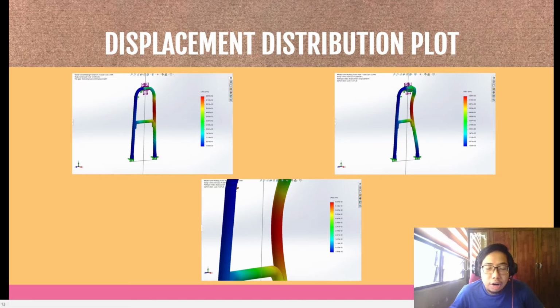When the force is exerted on the walking frame, the front side of the walking frame, as you can see in the picture in the blue color, will experience less deformation because of the fixture point, while the other side will experience more deformation. This case occurs in the high quality mesh as well as low quality mesh. As you can see, the blue color is the minimum displacement distribution, while the red color is the maximum displacement distribution.